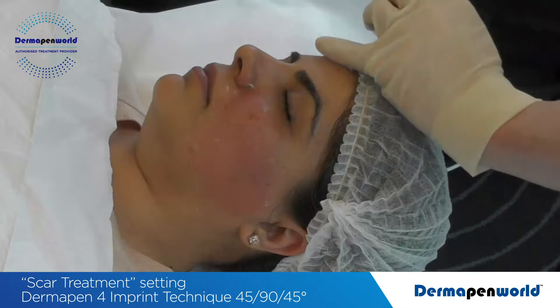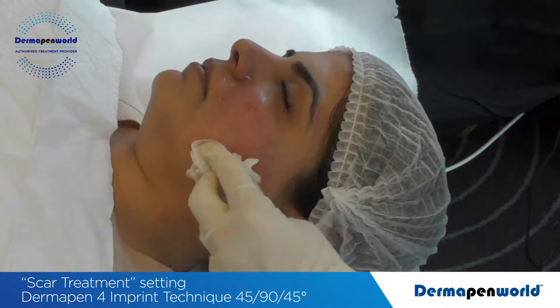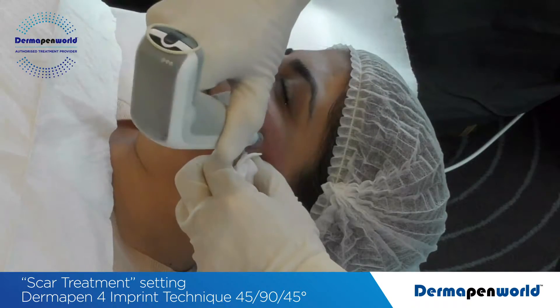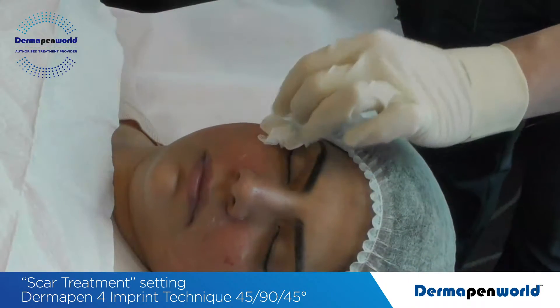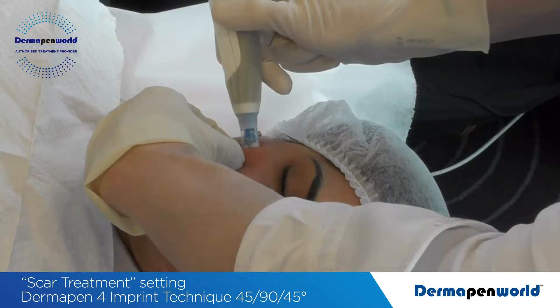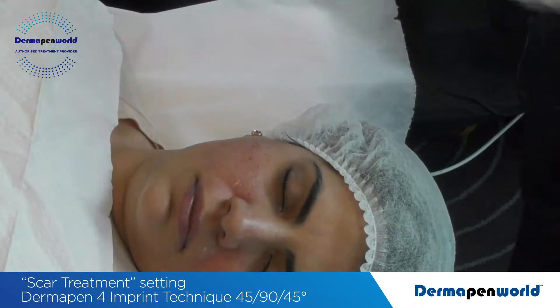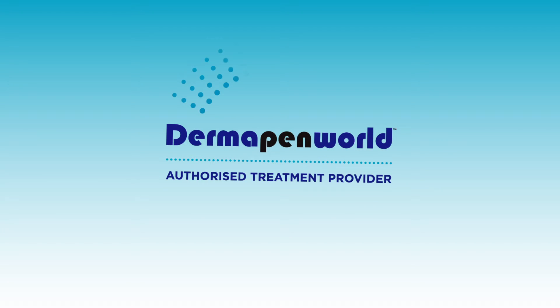See that visual endpoint — perfect. See how that has now completed, endpoint. Get the patient to turn. On this upper area here, perfect — you can see this localised collection here. Perfect visual endpoint. So now we can see how that works.